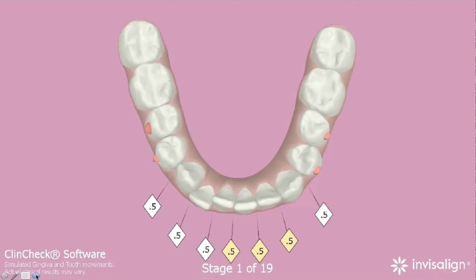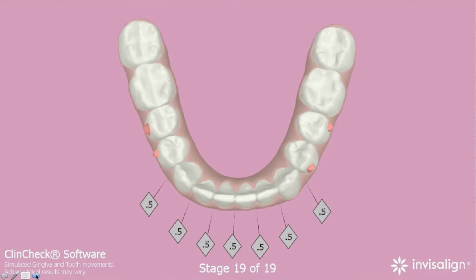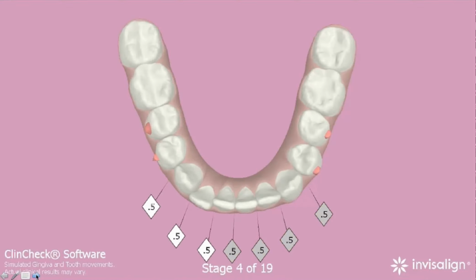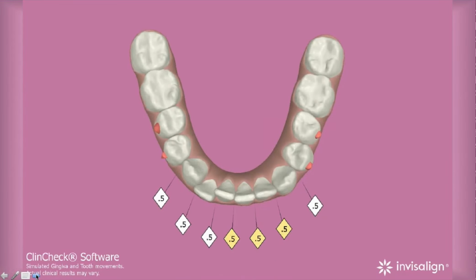Here's another example, not a good example. It's a bad example, and you'll see that during the course of that, you get that flickering of the yellow. This one does it now, this one does it later. Watch again, and you'll see that it's all over the board. And at the moment where they start to go in, are they straight? Here's a freeze frame of that.